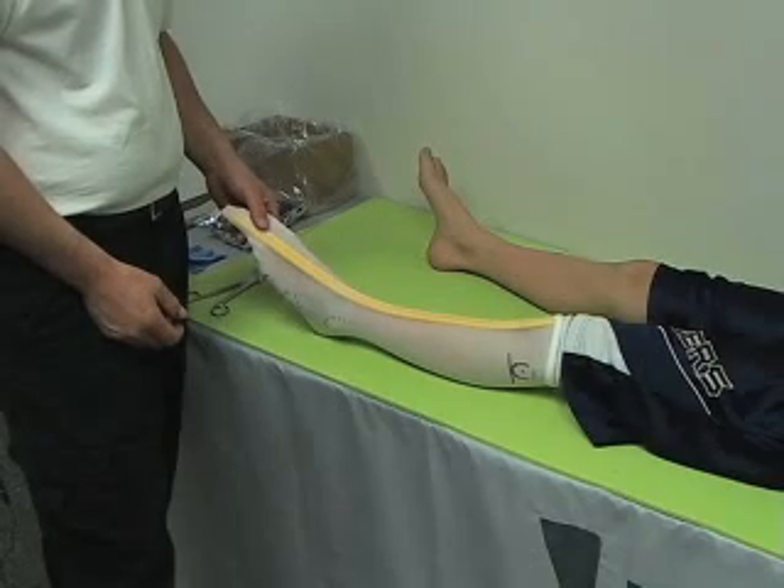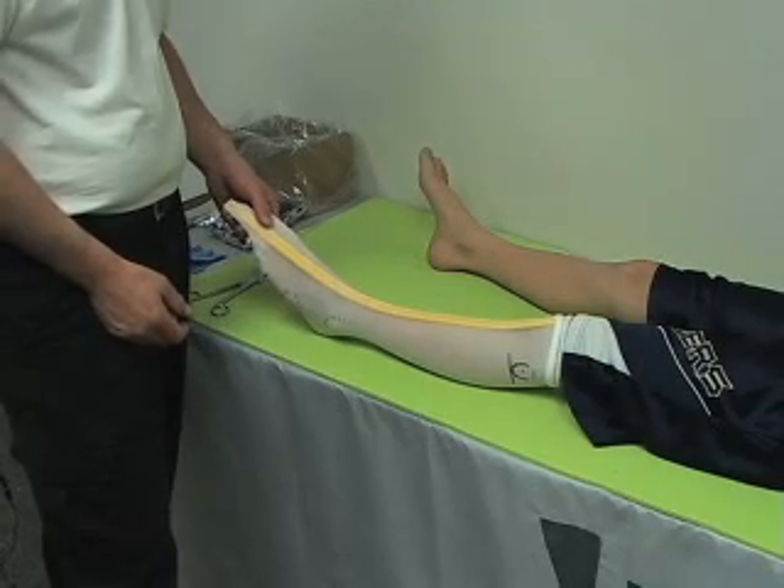Casting procedure for the DREFO. In this phase of the process, we are going to be casting the patient for a DREFO. It is very important to remember that during the evaluation process, you memorized or wrote down the alignment that was appropriate for that patient. It is very important that during the casting process, you try to get as close to that as you possibly can. Our recommended casting setup is as follows.